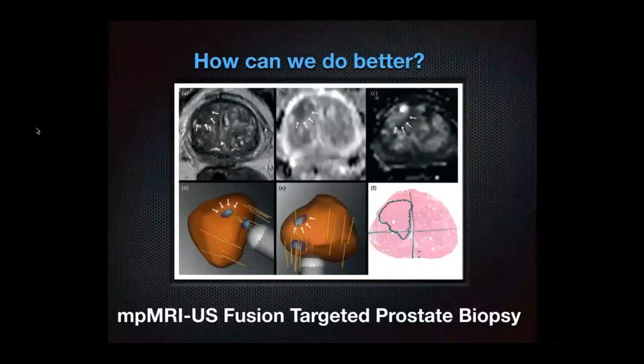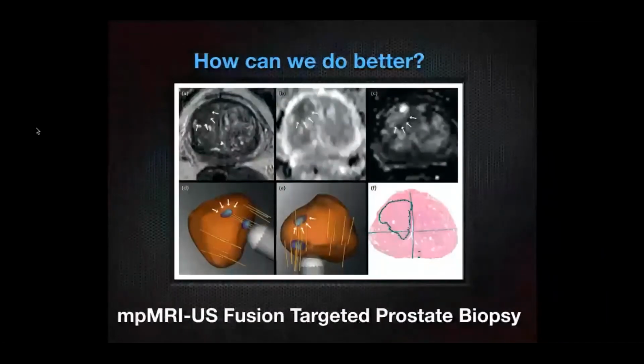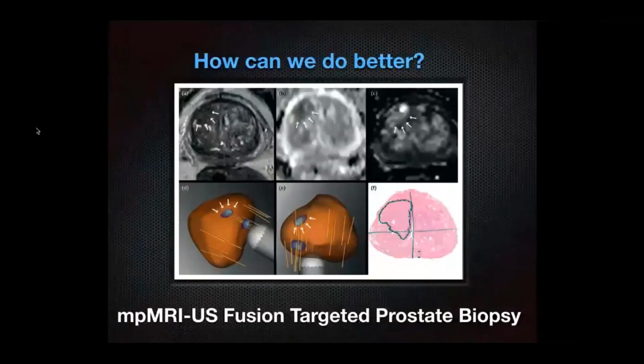And I spoke to you about the PIRAD score. Basically, the PIRAD score is a 1 to 5 scoring system where 4s and 5s out of 5 are very, very concerning for a cancer. And in our own studies, which mimic national studies, we have about an 87 to 100% positive biopsy rate for a PIRAD 4 or 5. PIRAD 3s are between 40 to 50% positive, and 1s and 2s are less likely to be cancer. So you can make very good clinical decisions based on what the MRI scan shows you.